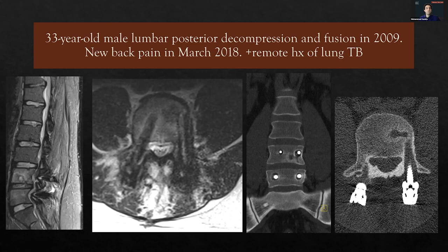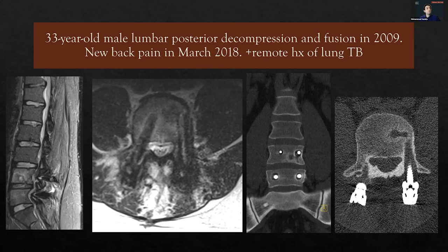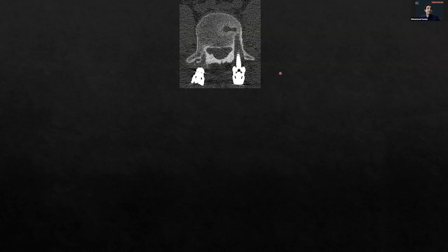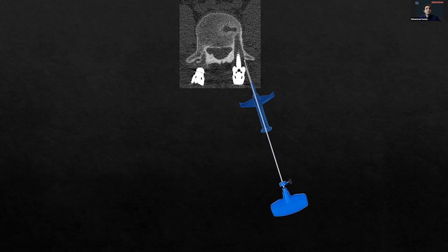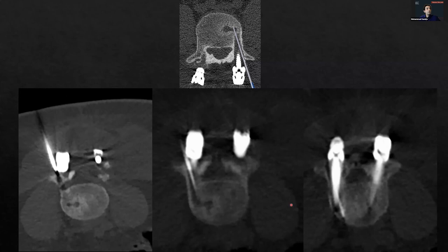Here is another example: a young patient with history of prior lumbar decompression and fusion, presenting with new back pain and a remote history of TB. Recent MRI and CT were suspicious for infection with possible intra-osseous collection and osteolysis around the hardware. We normally use the transpedicular approach, but there was a screw in the pedicle, and the posterolateral approach was also a concern due to scar tissue and possible neural damage. We discussed our approach with the spine surgeon and decided to place a larger introducer just adjacent to the pedicle, then advance a smaller biopsy needle coaxially through the lucency around the screw. We managed to get the biopsy sample and aspirate fluid, which ultimately showed acid-fast bacilli.